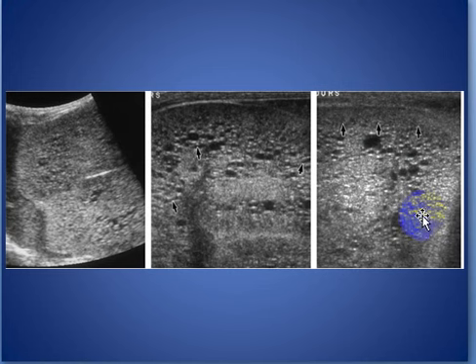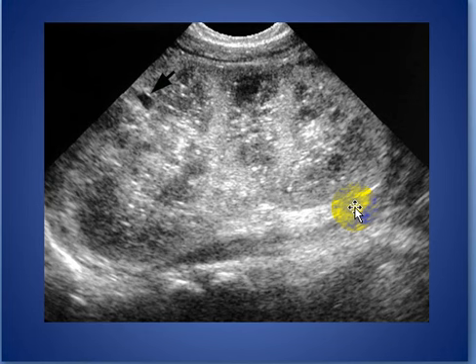Here, this is the ultrasound of another patient with bilateral autosomal recessive polycystic renal disease in an 11 hours old term male newborn, and we see the kidneys are enlarged and echogenic with multiple small cysts. Here, another patient with large kidney with multiple small cysts.